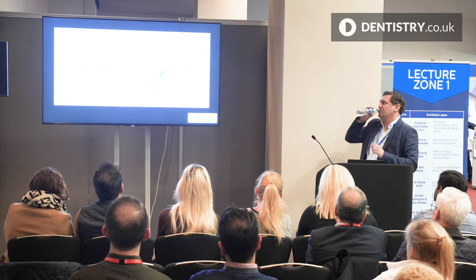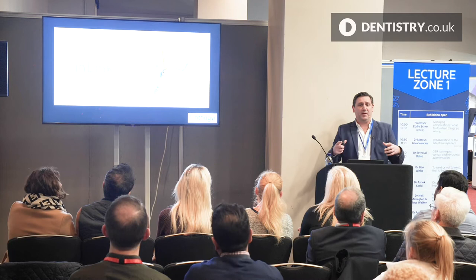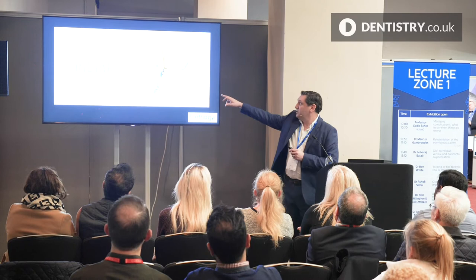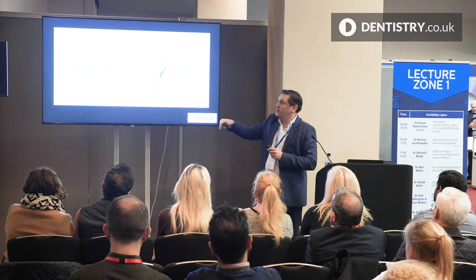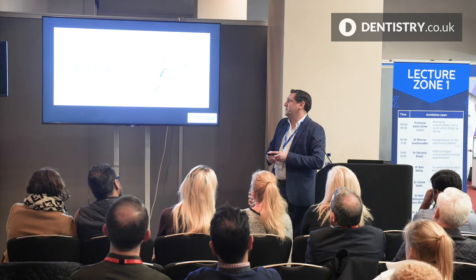The advantage with that is that we only have to have a very small access hole in our restoration, whereas if we have angled screw access, the hole has to be much bigger. It doesn't look very nice on our final restoration. Here, we only have to have a small hole that our driver has to pass through, so it's just a 2 millimeter hole the driver passes through, connecting this screw into the implant. So it comes in from this direction rather than in from the occlusal. So it also means we're not going to drop any screws in a patient's mouth.